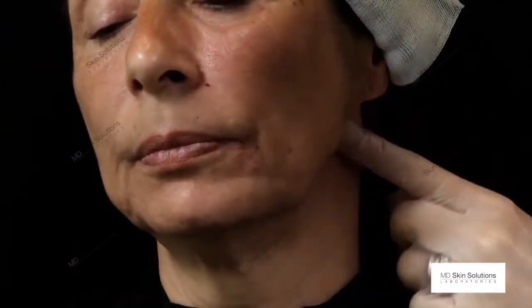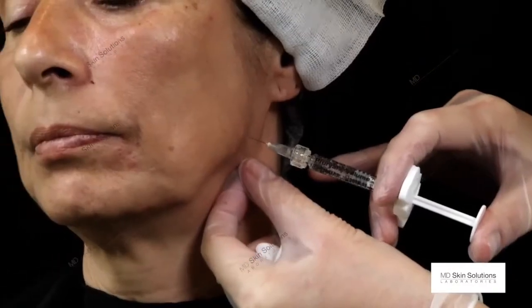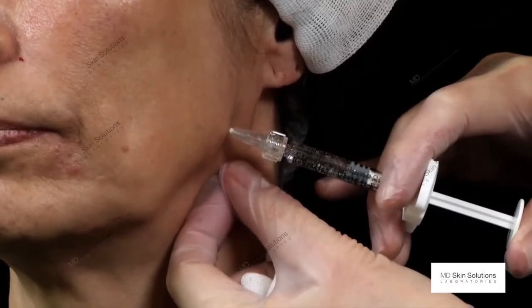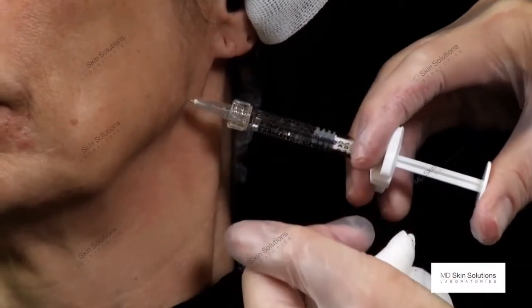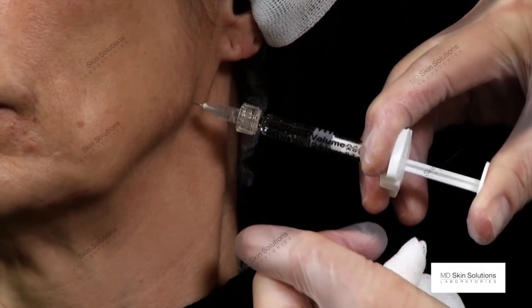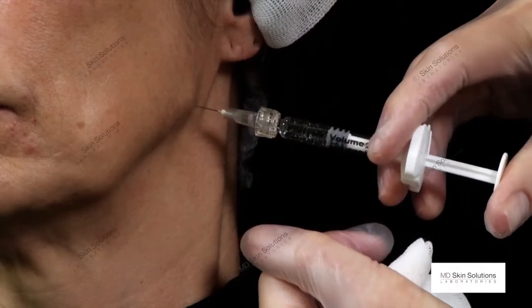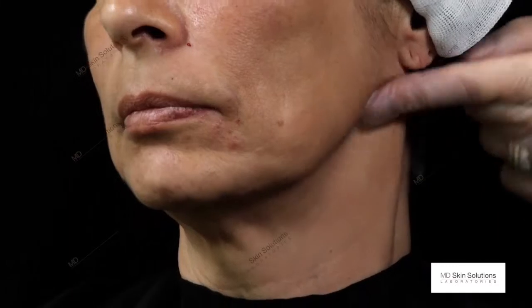And now we will address the mandible angle. Straight to the mandible, to the angle, I touch the bone and place a 0.2 of Pluryal volume in order to redefine this angle.